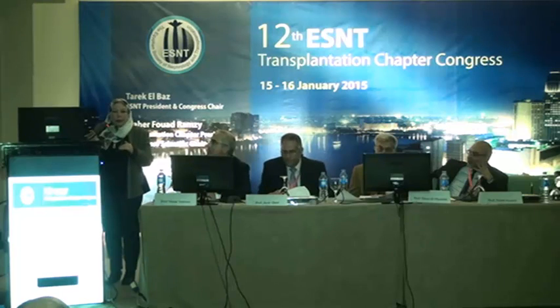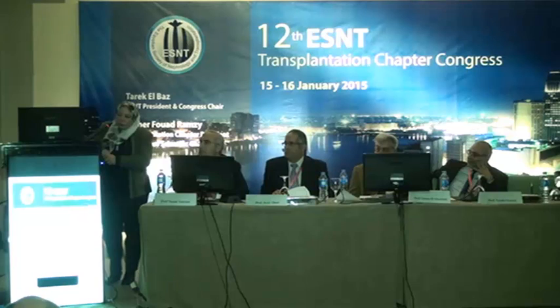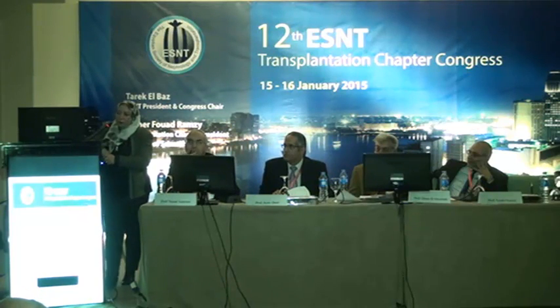So after doing the PRA, we can differentiate which of these antibodies are complement activating and which are non-complement activating. On the same issue which Professor Yasser mentioned, 25% subclinical antibody-mediated rejection in negative flow cytometry. Yes. So if we don't have the virtual cross-matching, we think that we are immune if we do CDC negative and flow negative. 25% is a big number.